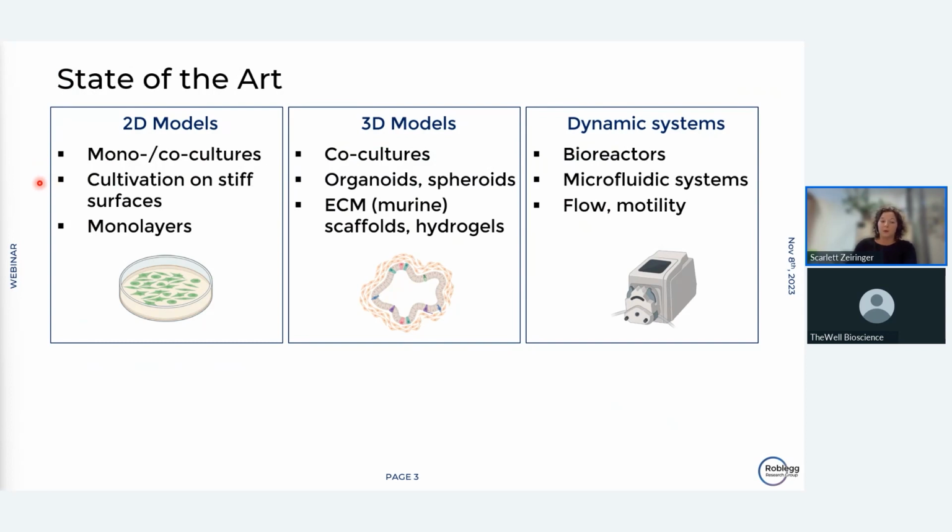The most used and best known cell lines representing the small intestinal epithelium are the Caco-2 cells and the goblet cells, HT29-MTX cells. Both cell lines are derived from human carcinoma and show high similarity with the small intestinal physiology of humans. Both cell lines need to be cultured for up to 3 weeks to reach a full differentiation and full functional model.